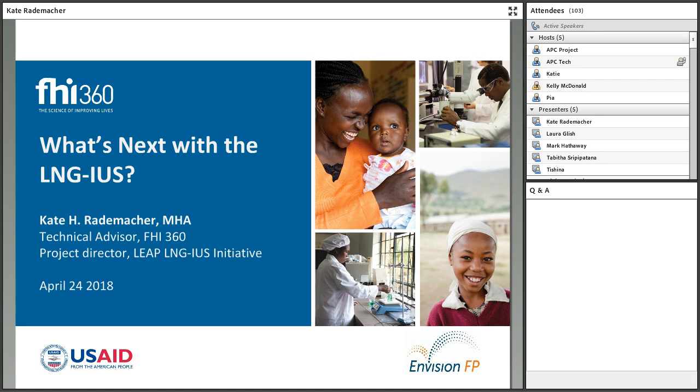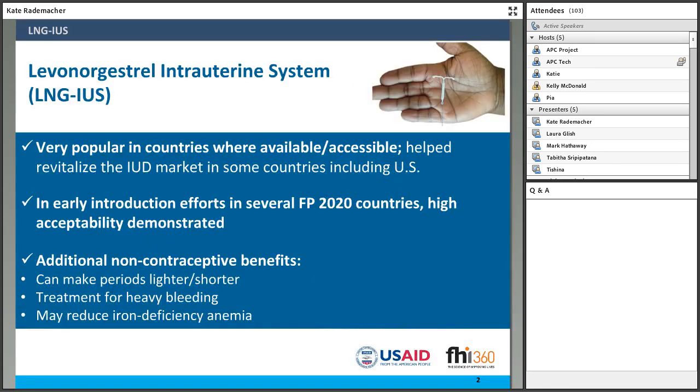Great. Okay, thanks again, Tabitha, and thank you so much, Mark, for that wonderful overview. In my presentation, I'm going to do a deeper dive about the current status of the hormone-releasing IUD, which in many settings is not available or is underutilized. The method is also referred to, as Mark noted, as the LNG-IUS or the IUS, and I will refer to it as the LNG-IUS in my presentation today.